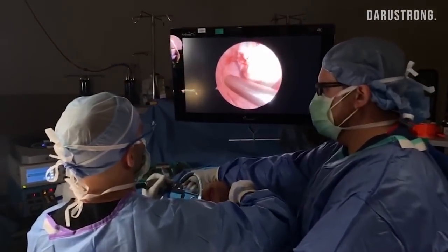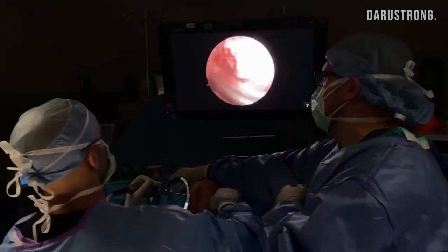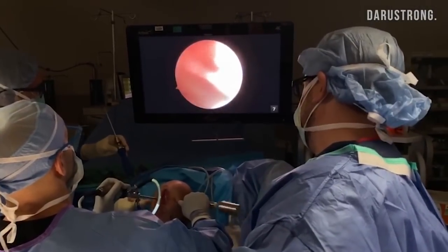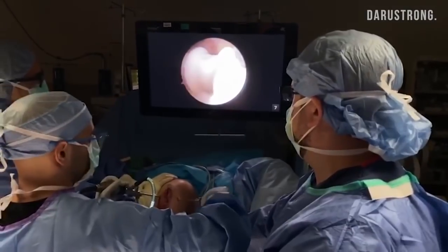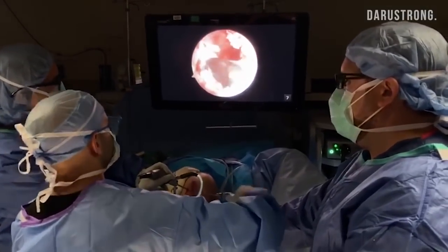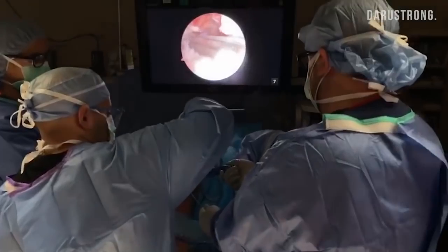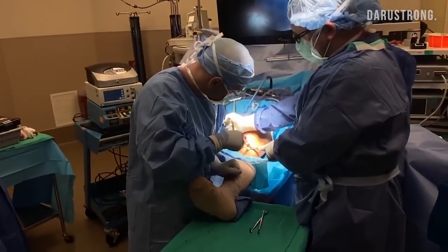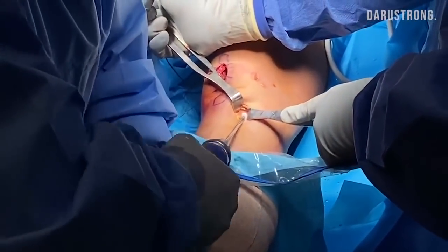We have passed the ACL bone plug into the femoral tunnel. Now we have to drill a screw here — I'm going to make a path for the screw. This is called a tap. Phil's got very hard bone, so let's go ahead and mallet that and make a tract for our screw. It's an Arthrex biocomposite screw, so this will turn into Phil's own bone over time. I'm feeling good pressure — there we go. You guys hear that? That is good fixation — really tight. That is going to work well. We are fixed on the femur.